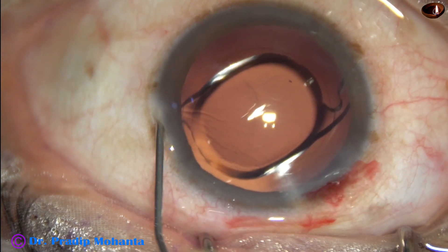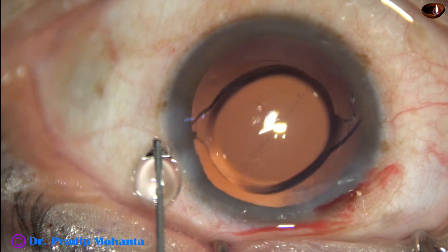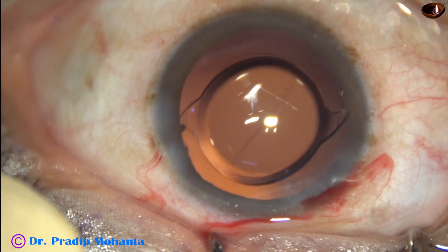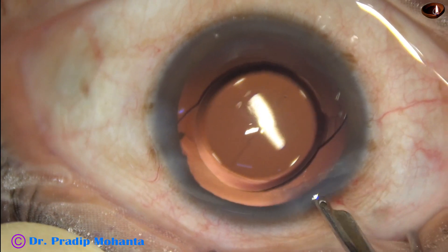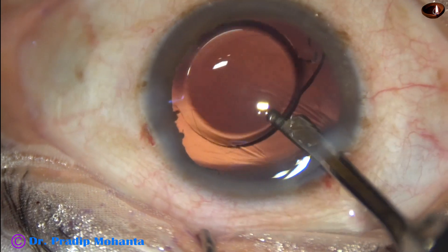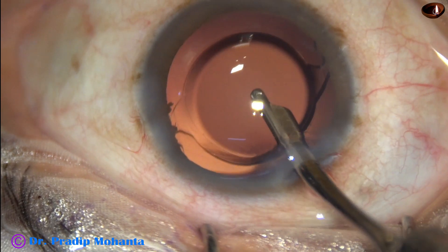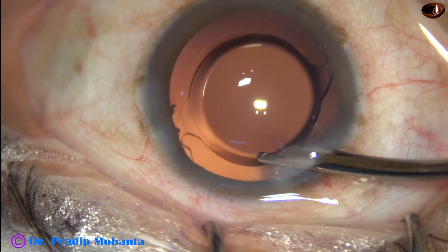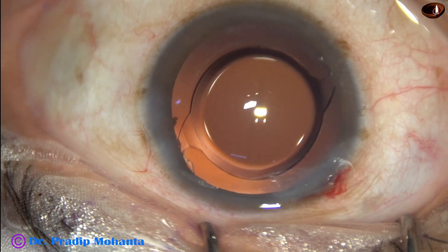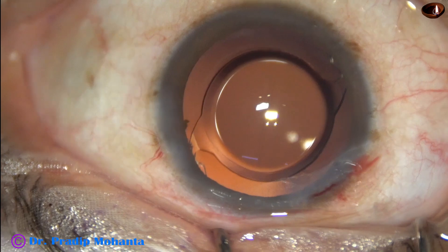Now the side port is closed by corneal stromal hydration on either side of the side port. A final lavage of the anterior chamber is done. A gentle stream of BSS is directed towards the corneal endothelium to remove the viscoelastic that sticks to the back of the cornea. The capsular bag as well as the anterior chamber is irrigated. The anterior chamber is formed very nicely with the help of the Simcoe cannula. Integrity of all the wounds is checked.